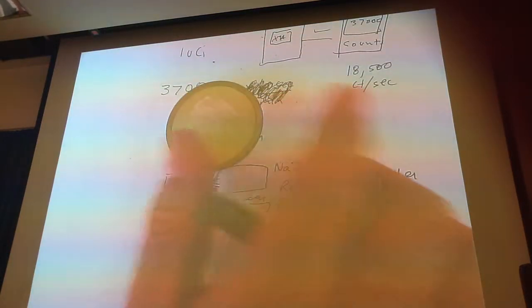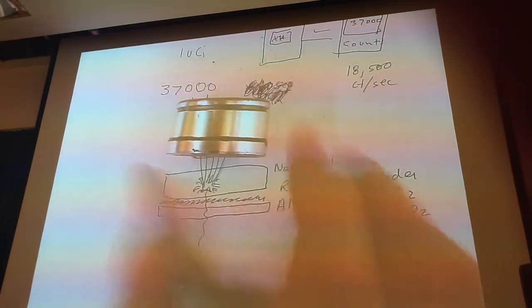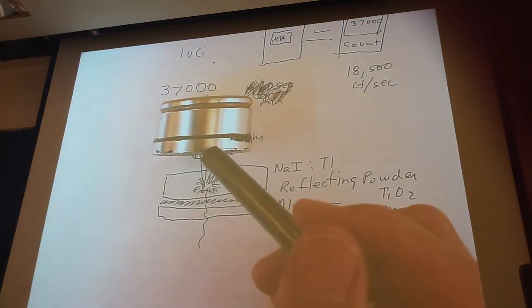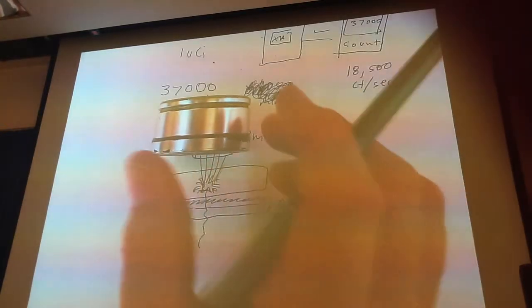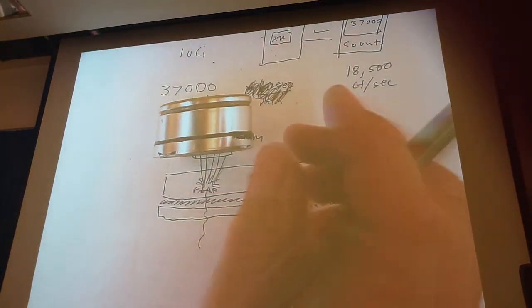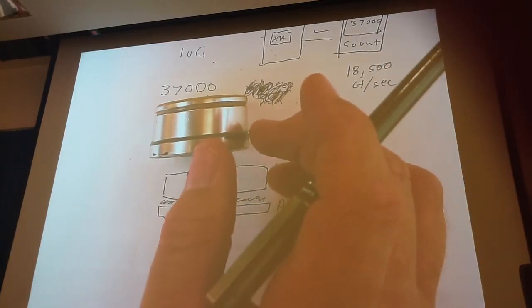Yeah, I mean, it doesn't happen very often, but you know, it happens. So you just make, and we can grow these crystals almost any size we want. You can't see how thick this is, but typically for most gamma cameras, it's anywhere from about 1/4 of an inch for what we call high resolution crystals, all the way up to about 1/2 of an inch for high sensitivity crystals. In other words, the thicker it is, the more radiation it's going to stop. Okay? But the problem is you lose resolution.